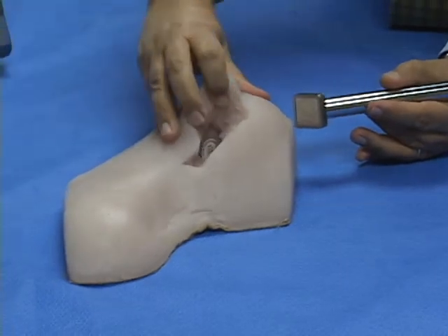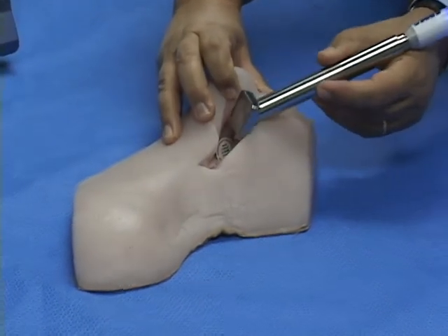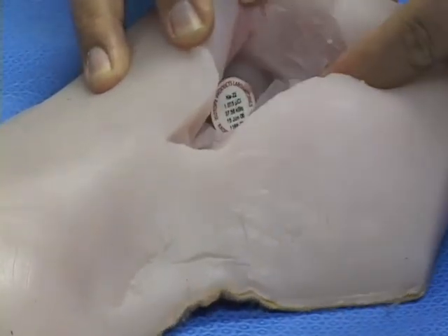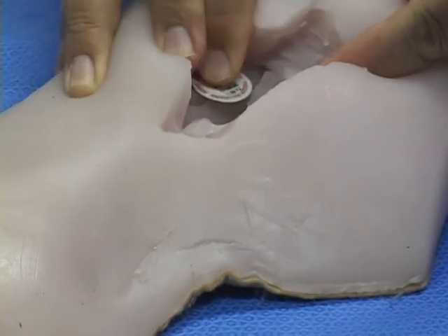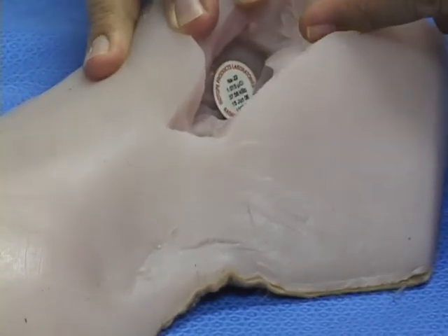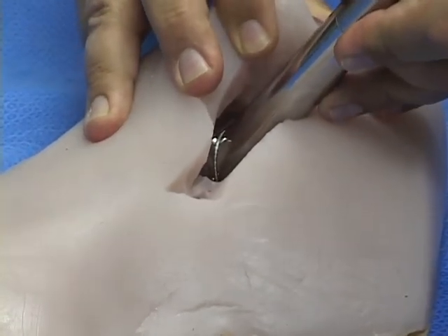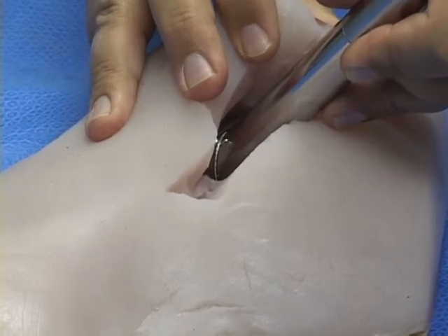At this point in our surgical simulation, the surgeon has made the incision and removed the bulk of the tumor. The margin must now be checked to verify that all the radioactive tissue has been excised. You can see here that we have placed a radioactive source in the incision to simulate residual radioactive tissue. The surgeon places the marginator's sensitive surface over the area to be checked and holds it there for 10 seconds while the image data is collected.